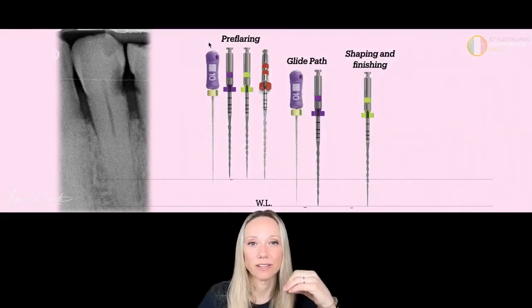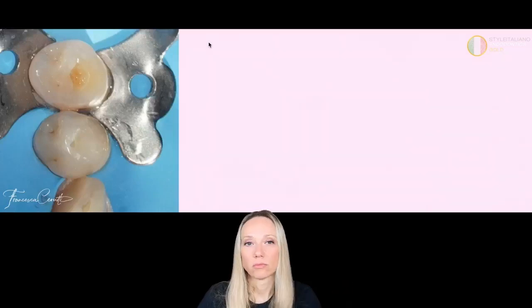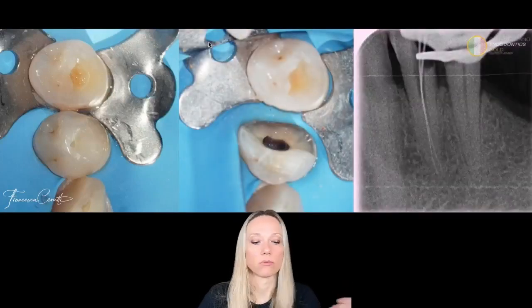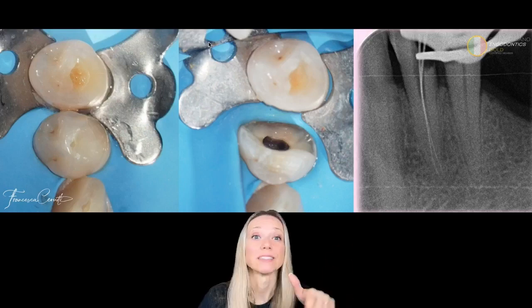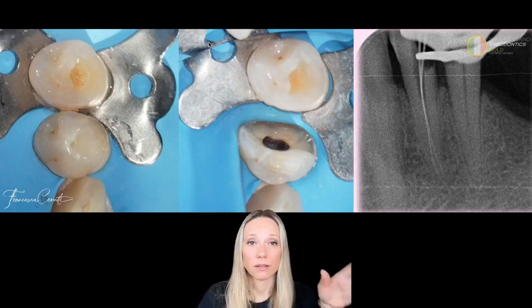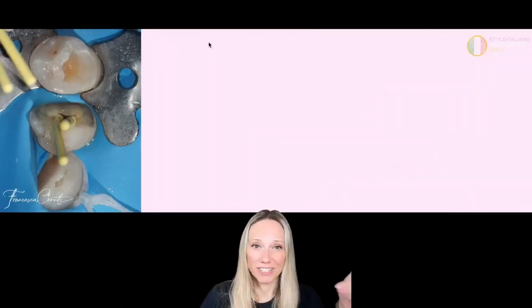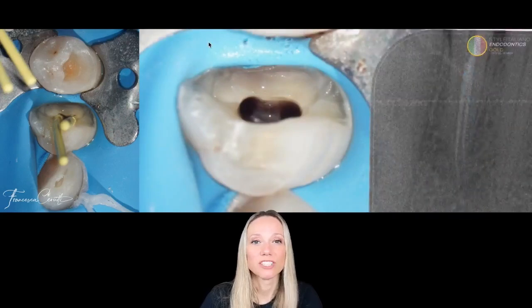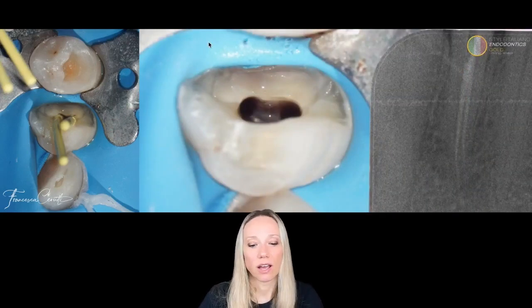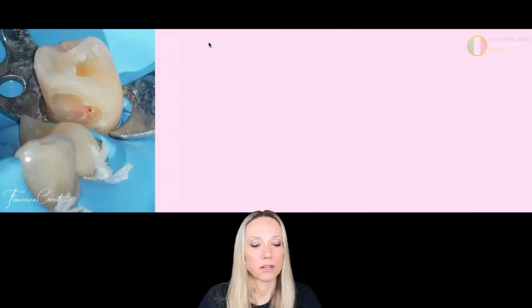So the fact of having a file that I can slightly pre-bend and it's going to stay like that helps me a lot. And I do all the steps in the same way. So remove the decay, negotiate the orifices, do the coronal pre-flaring with all the sequence up to 2506, and then manual file pre-bend, I arrive to the working length. Once I did it, I pre-bend 1303 and I go. And I finish to 2004 because there is no reason to enlarge more. I am able to clean, I'm able to feel good.